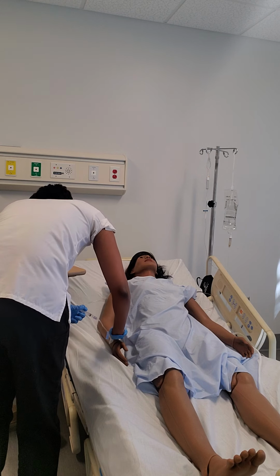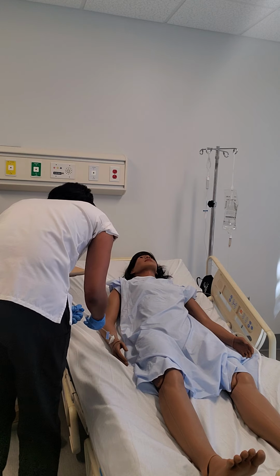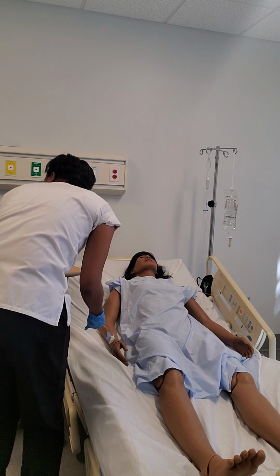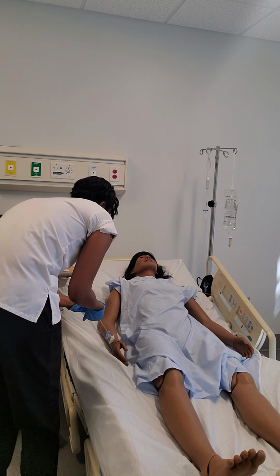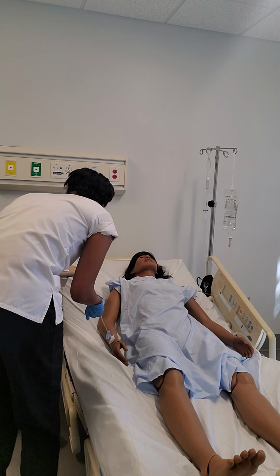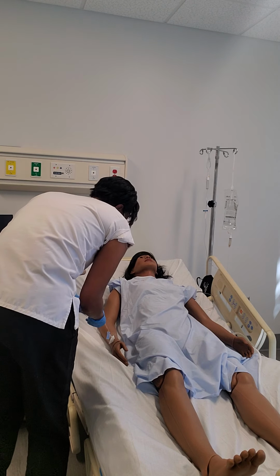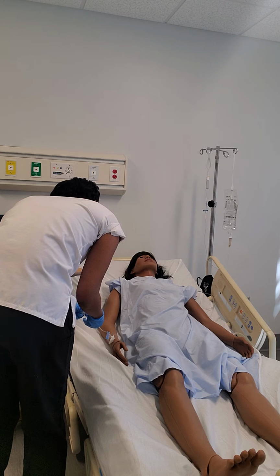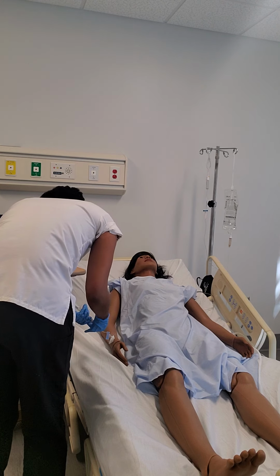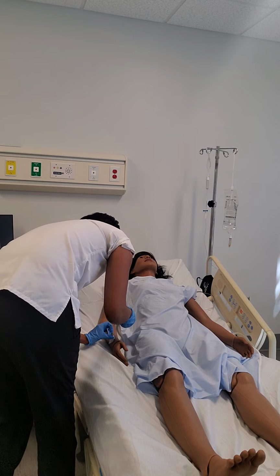I'd ask the patient, make sure that you're not in any pain, that I'm not seeing any signs of infiltration, and that I don't see any edema. So it's been 2 minutes on that. We have a new alcohol pad that I'm cleaning off. So I scrub the hub one more time. New saline flush. Put that back on, and then I push another 3 to 5 milliliters of the saline. Just clean that line. Okay, these are going in the trash, so then I clamp this back once it's done.